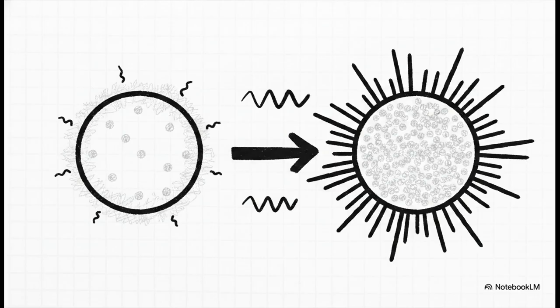Here's why. By using a long TR, we essentially eliminate any contrast differences that rely on T1 recovery times, simply because we've let everything fully recover anyway. And by using a minimal TE, we eliminate contrast differences based on T2 decay times, because we haven't even given the signal time to decay. So the only major variable left dictating the strength of the signal is simply how many protons are physically present in that specific tissue. The denser the protons, the brighter the signal. It is a brilliantly elegant way to isolate just one physical property of the human body.